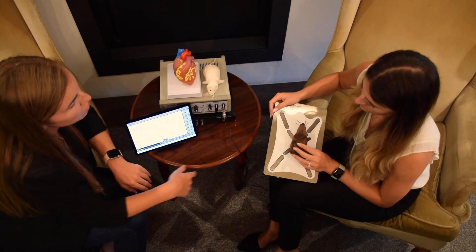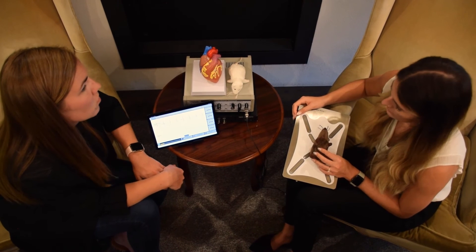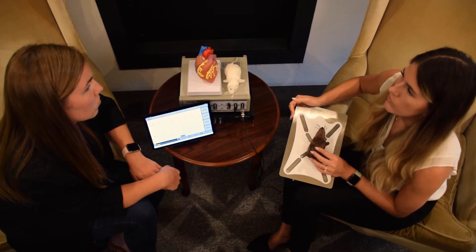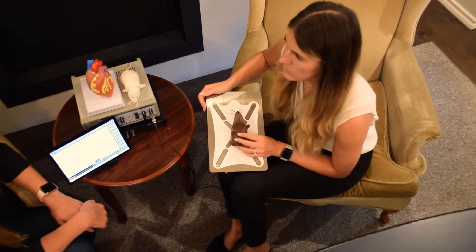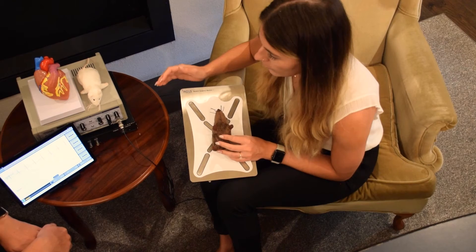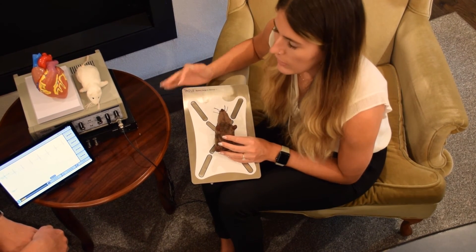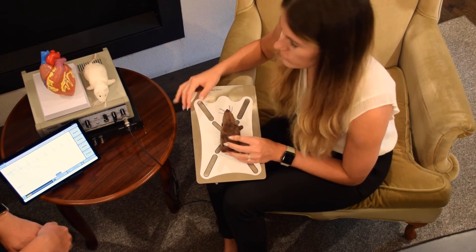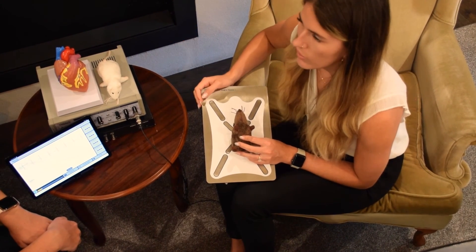The rodent surgical monitor can also be used on its own. It's a great tool for anyone performing any kind of procedure where the animal needs to be anesthetized, whether invasive or non-invasive. It monitors all vital signs and keeps the animal warm at physiological temperature to maintain safety and health, and also helps with recovery and post-surgical care.